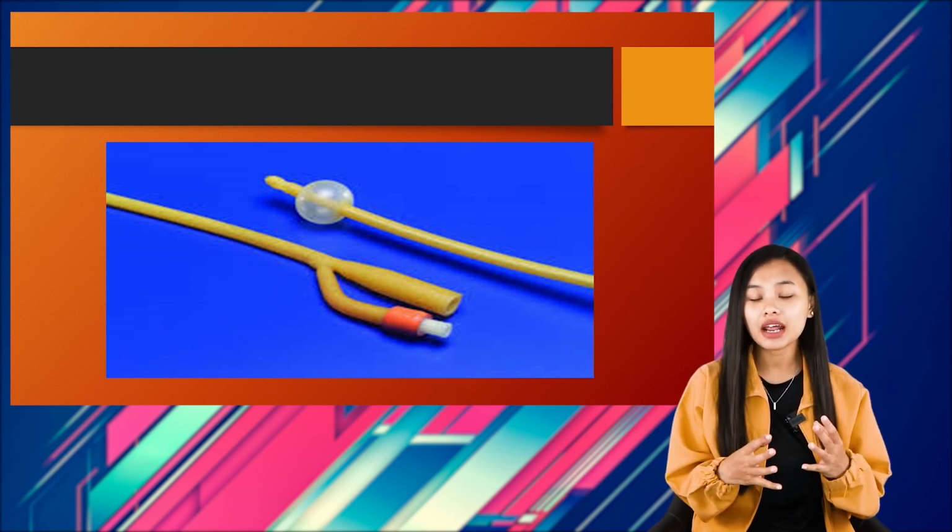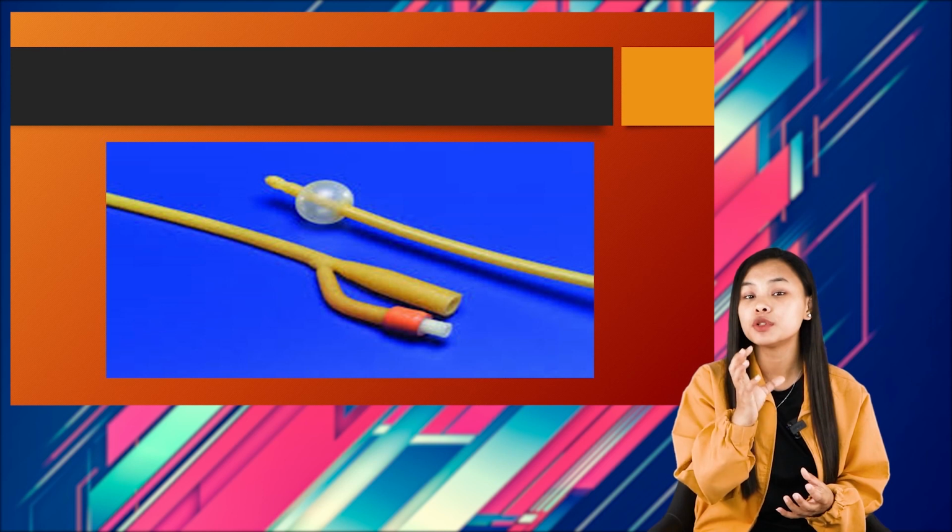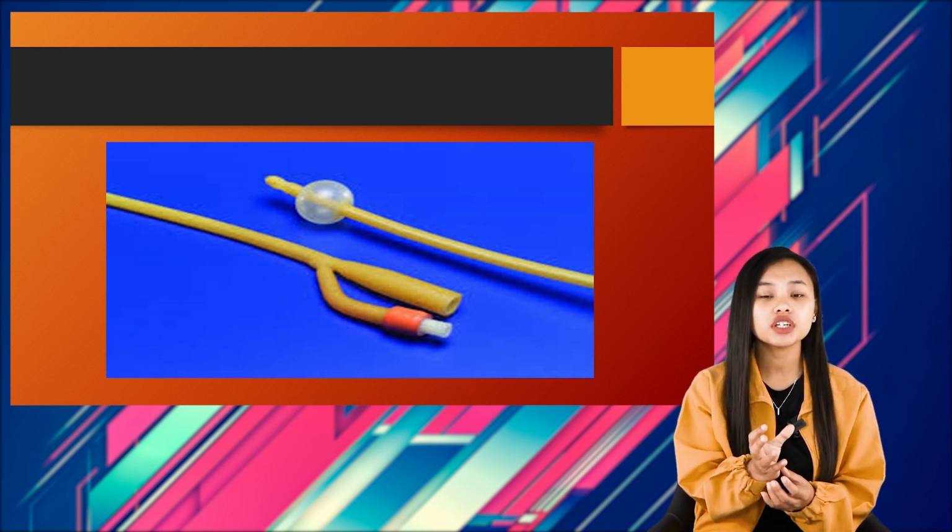Again, as you can see in the picture, this is how an indwelling catheter looks like. At the tip there is a balloon. Once this catheter is inserted, the balloon will be inflated, and the size of the balloon will be larger than the opening of the urethra. In this manner, it will help to retain the catheter in place.